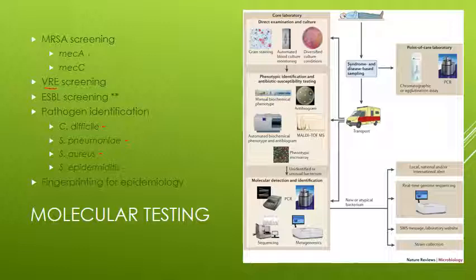The molecular testing is definitely more sensitive, and it allows us to get more information quicker. And you can see this little cartoon here. We have all the different identification methods. You have everything from your API, very manual, to your MALDI-TOF, okay?